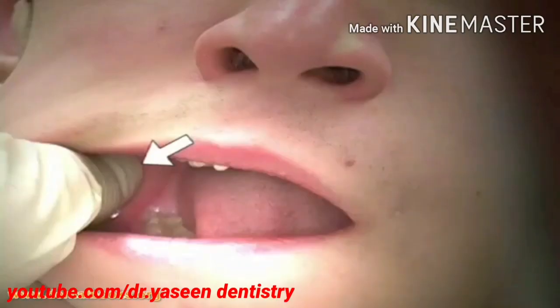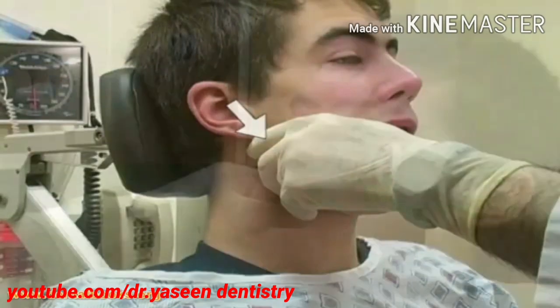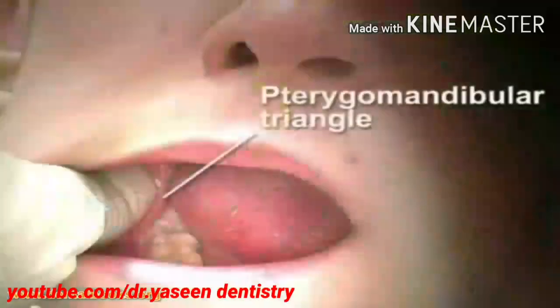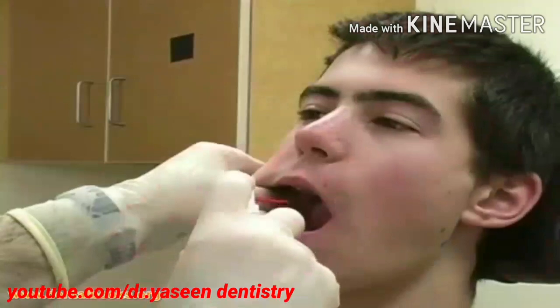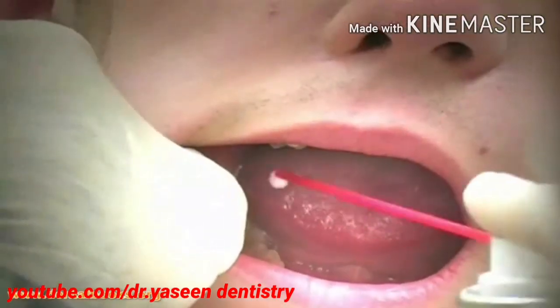With your thumb in the mouth and your index finger placed externally behind the ramus, retract the tissues toward the buccal or cheek side and visualize the pterygomandibular triangle. Anesthetize this area with a topical anesthetic such as benzocaine.